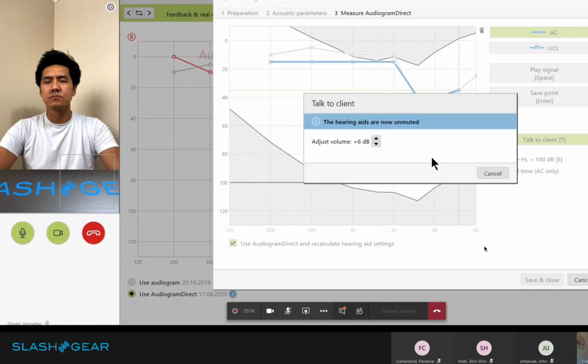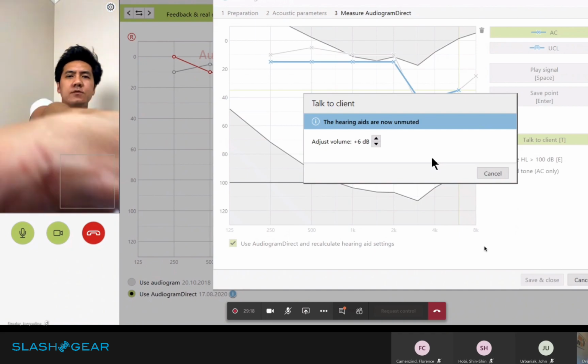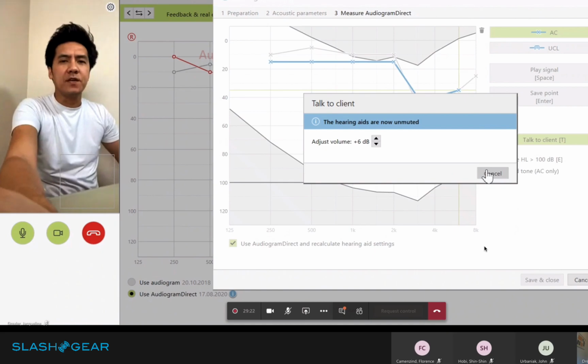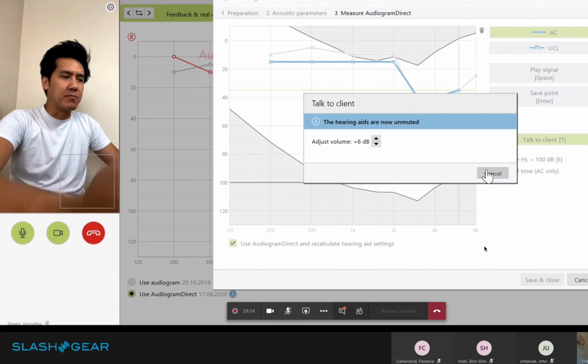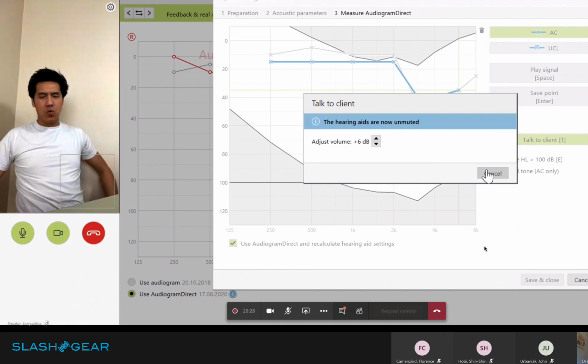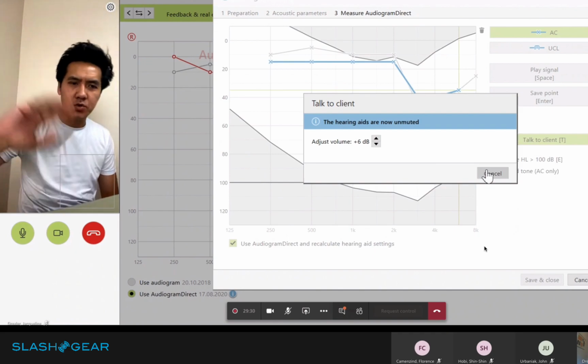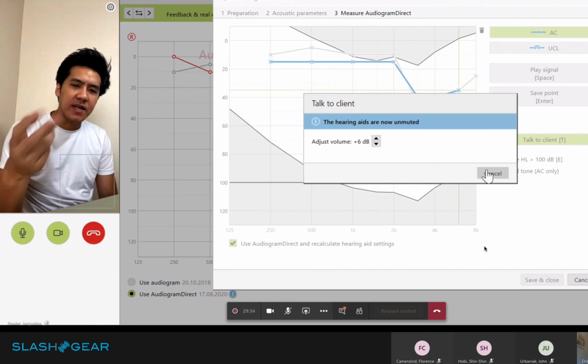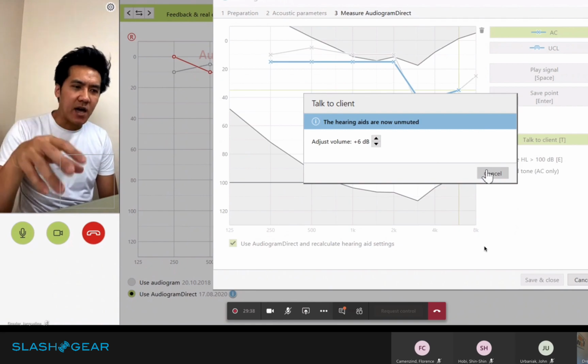Okay, we just finished. So now I'm going to save the results and then we'll proceed. I think the only feedback that I can give to that process is the sound. If there's a way for the team to mute completely your side, because I was also contending with the rustling and the sound and the clicking on your end.